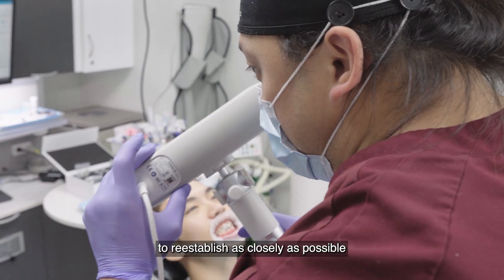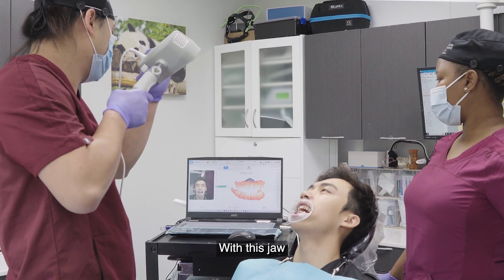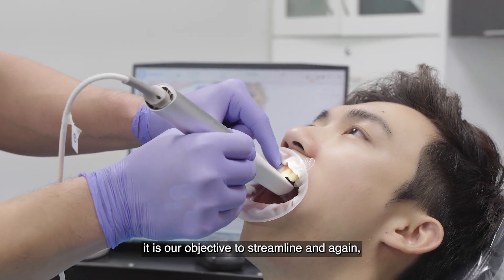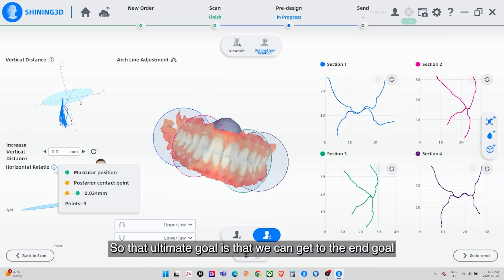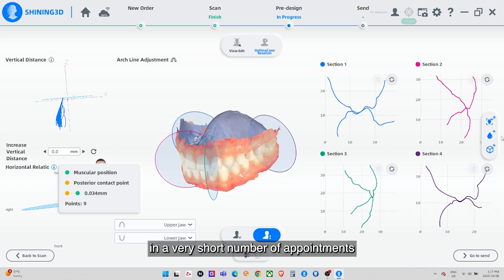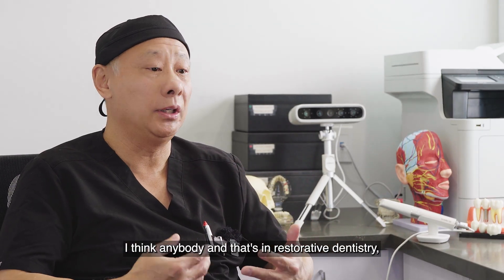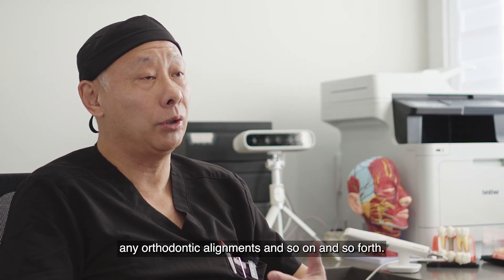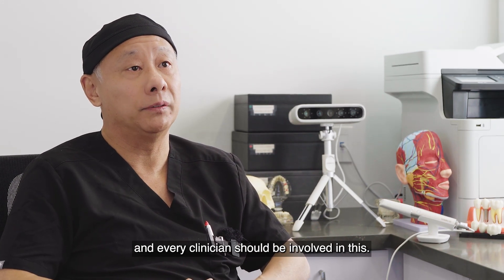The ultimate goal is for us to re-establish as closely as possible the patient's natural dentition. With this jaw relations record and virtual articulation, our objective is to streamline and communicate this to the lab and to the patient, so that we can reach the end goal of having the patient very comfortable in a very short number of appointments. I think anybody in restorative dentistry, anybody doing full mouth reconstructions, any orthodontic alignments — it's literally everybody, every patient, and every clinician that should be involved in this.